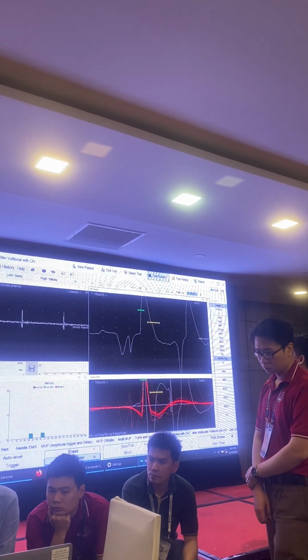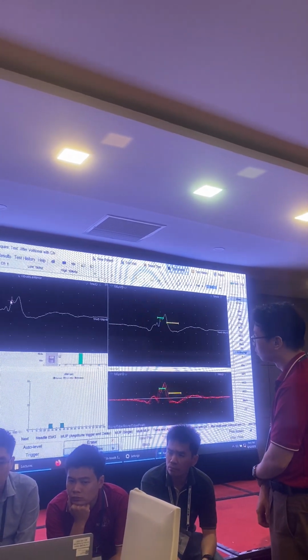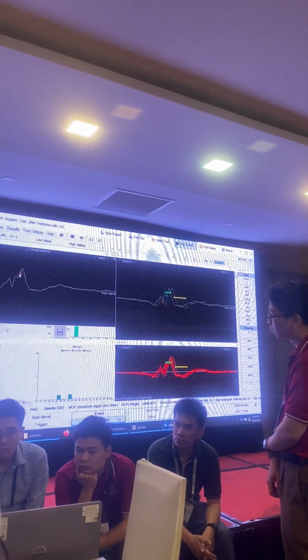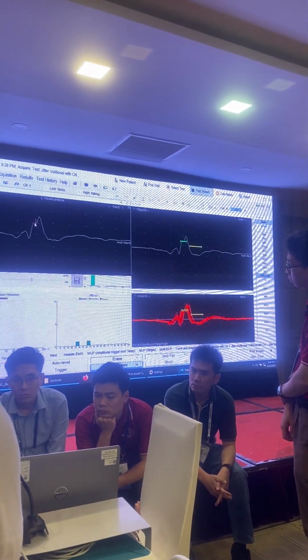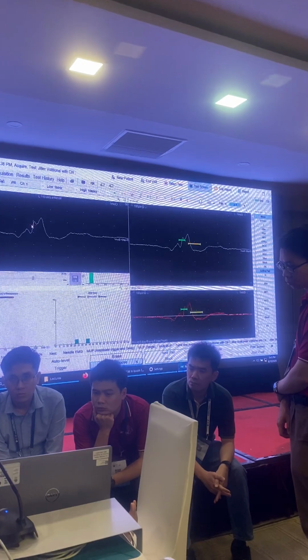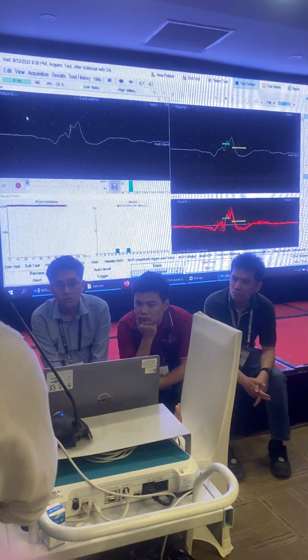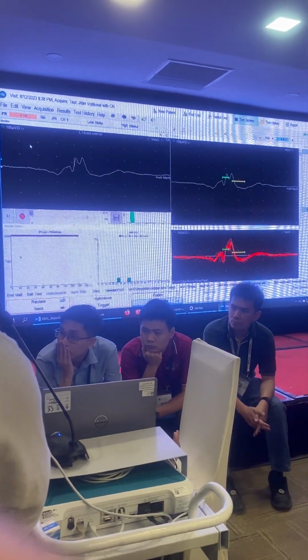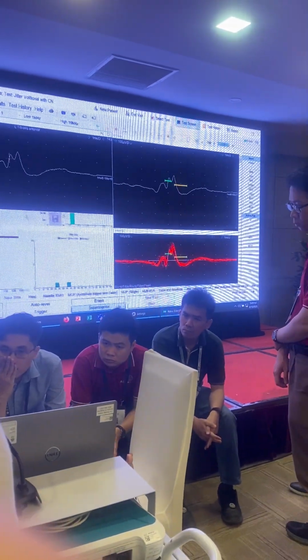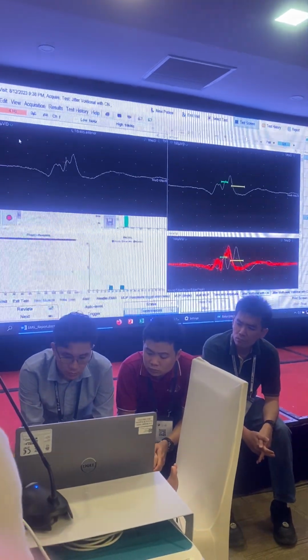I can hear something in the background. See, that's unstable. The waveform keeps changing. The amplitude is low over here, so I'm not going to accept it. I just want to indicate that I heard it. So that's what you do. Always keep listening. Now adjust the position.